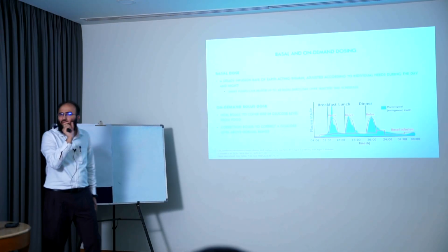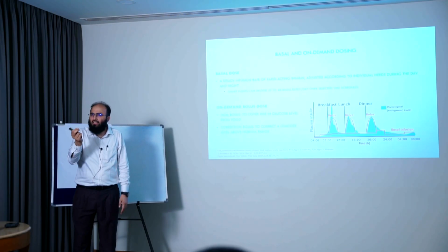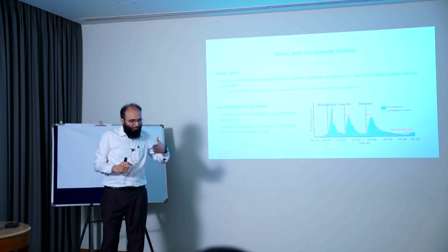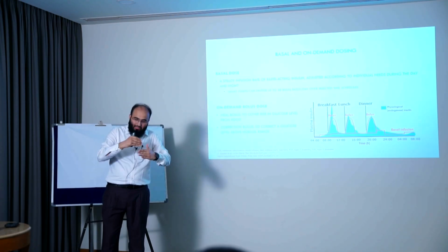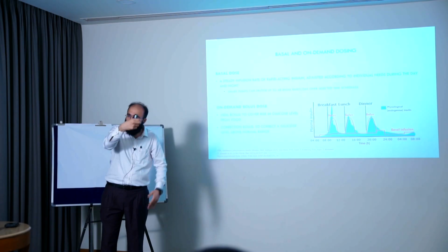Those correction boluses are very small. It will not be like 1 unit, 2 unit also. It will be 0.6 unit, 0.8 unit. That is the kind of correction boluses, because already 1.2 unit of basal is going on. Despite that, it is high. So it gives additional 0.8, 0.6.